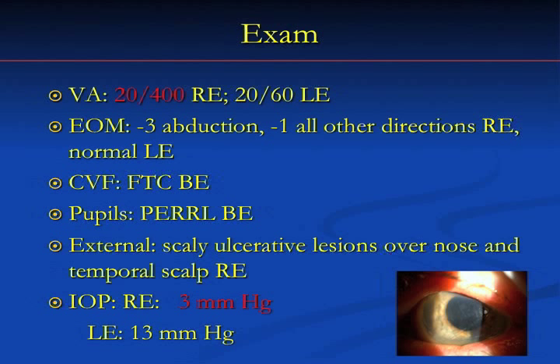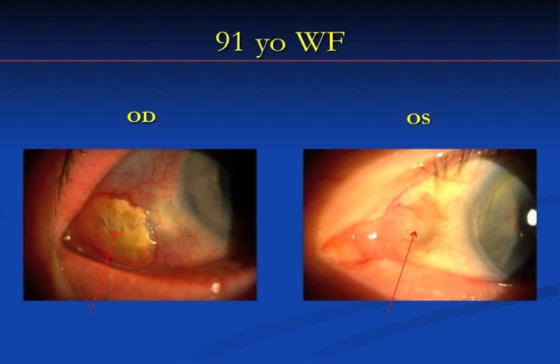And when we look at the slit lamp, I hope that it's a little bit visible. It's not the best photo. There were descemet folds. The anterior chamber was pretty shallow. So there was some leakage suspected, but when we did the typical Seidel, I didn't see any leakage. Away from the cornea, she did have this very thick, yellowish, hard mass, and this was the occurrence that brought her to the clinic together with the pain. Every time she was blinking, she was having tremendous pain.